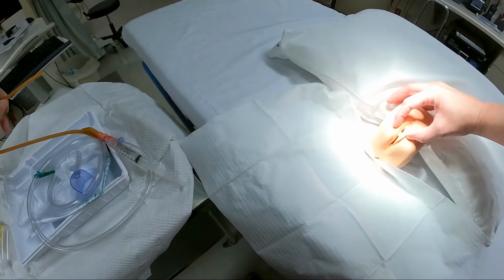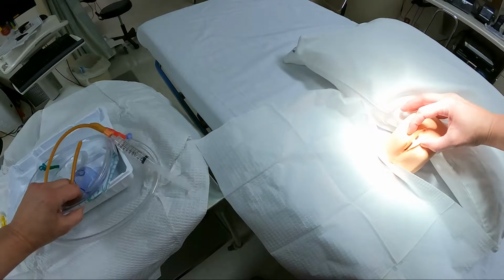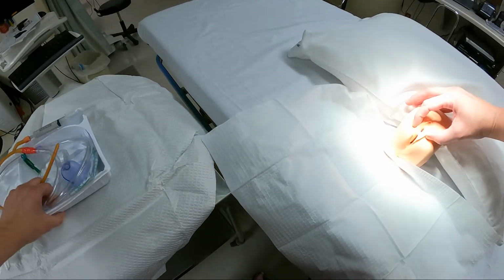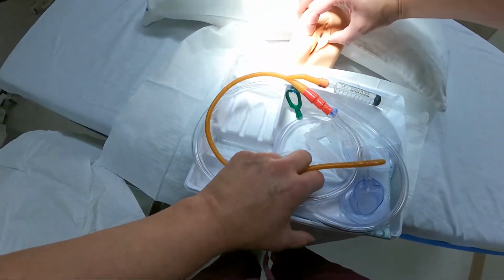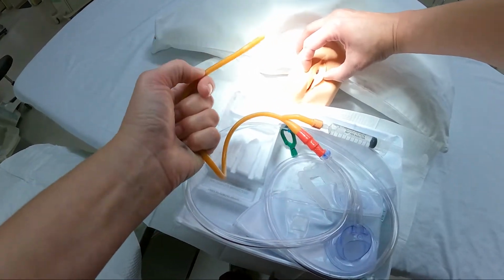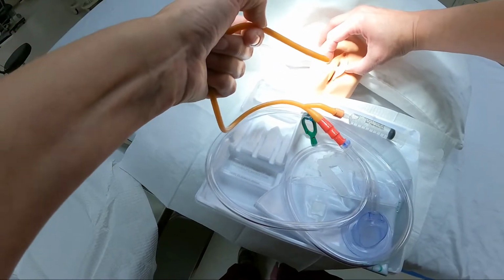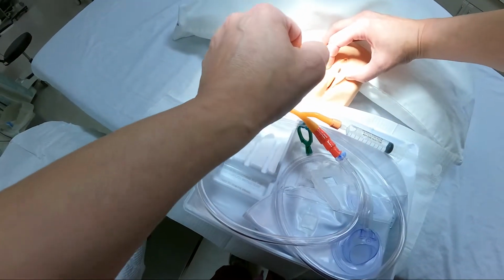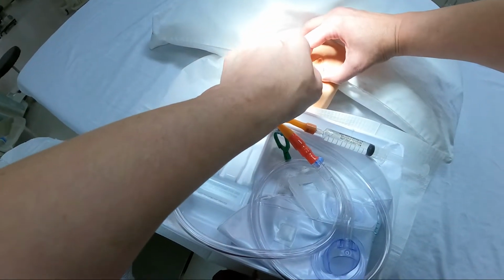Now, having said that, it all depends. If my patient is not kicking and they can cooperate, I will bring the entire tray in between their legs, but sometimes you can't do that. The important thing is that when you pick up the catheter, you have it gripped and you don't let it go, because you don't want it dangling, you don't want it touching anything. So again, you would, and it's already lubricated, we hope.